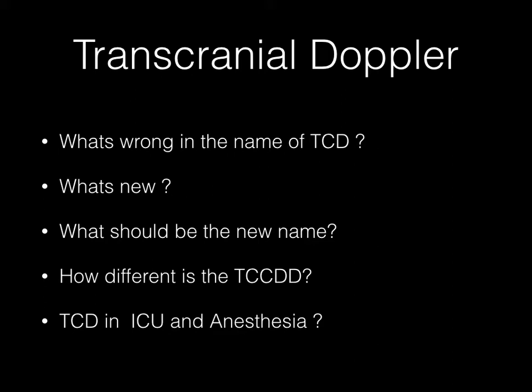So basically, what used to happen at that time, a Doppler technician used to come with a probe which was fixed, like the middle cerebral artery blood flow would be found from the left side earlobe or just above the temporal bone, 6 centimeter. So it was completely blind.